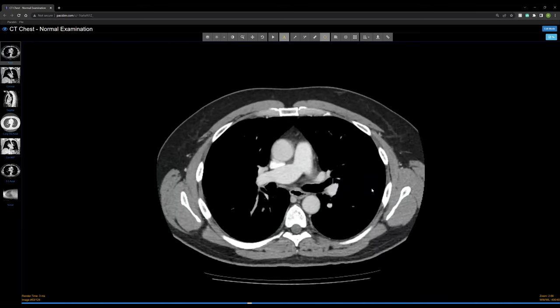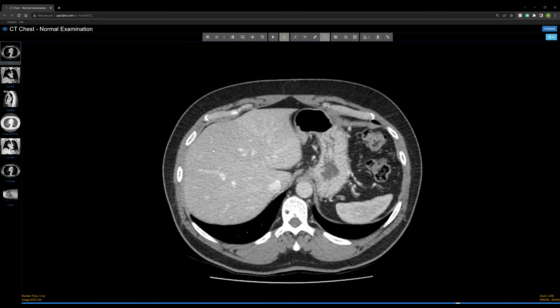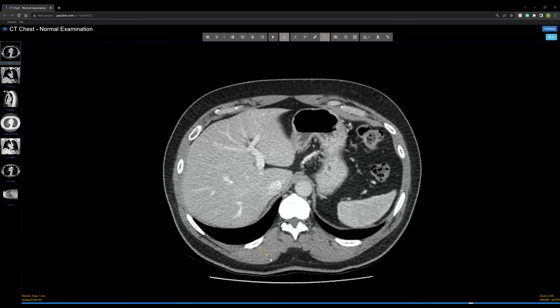Scrolling down to the abdomen and placing an ROI on the gallbladder — which is filled with bile, basically water plus other things — the mean is about 19 Hounsfield units, close to zero. Simple fluid is typically anywhere from zero to 20 Hounsfield units. Placing an ROI on the muscle belly of the spine reads about 60 Hounsfield units. And on the subcutaneous fat, it's about negative 110 — confirming that subcutaneous fat is dark, gas is darker, and soft tissue is brighter.